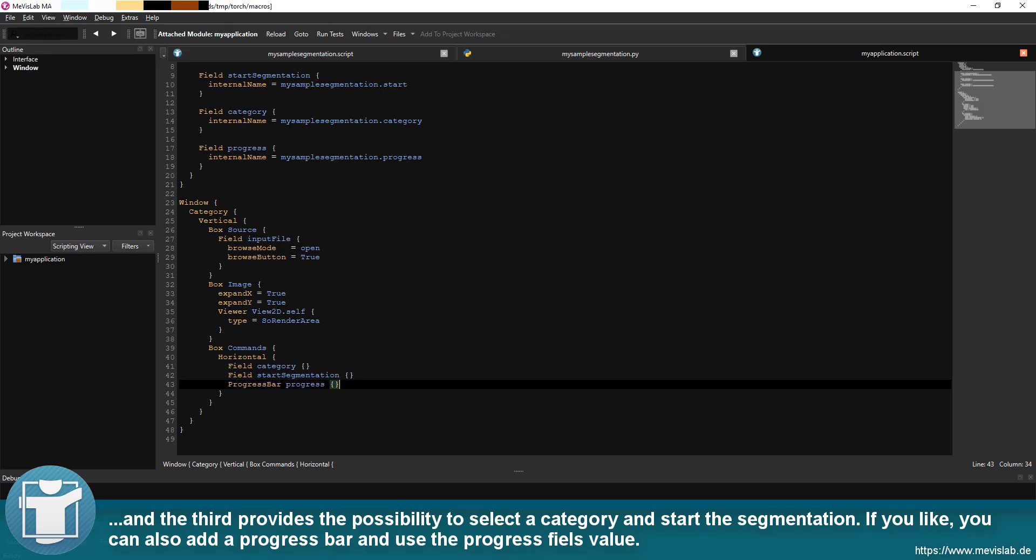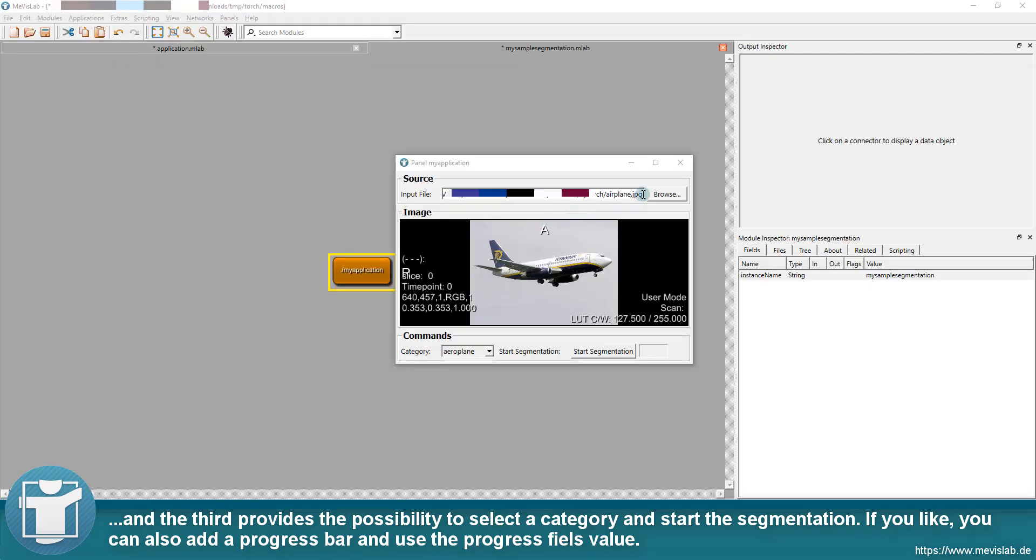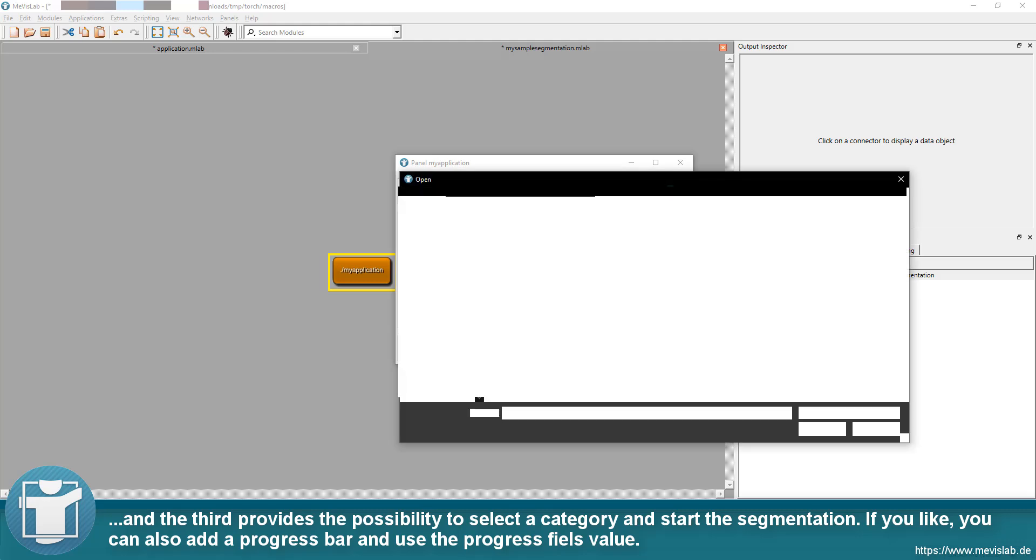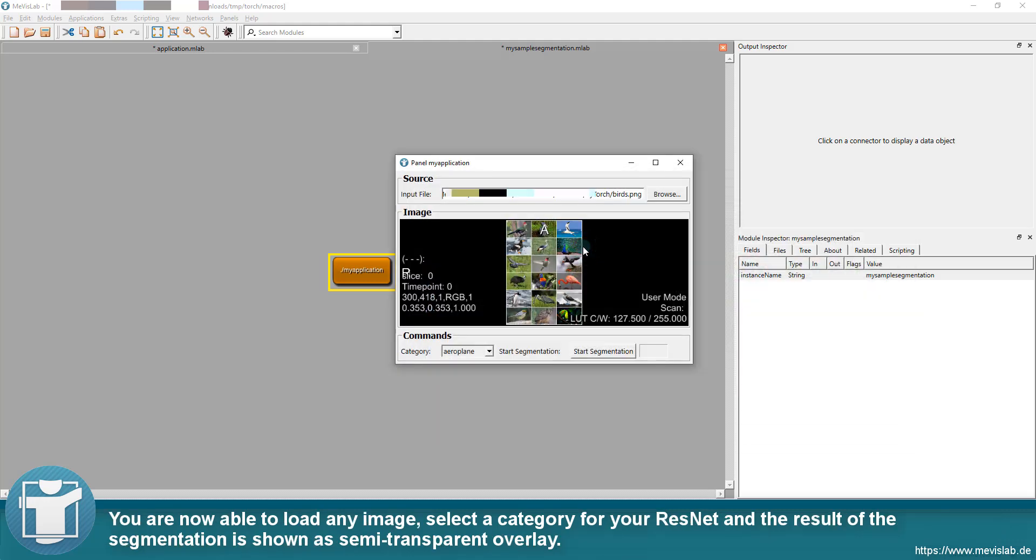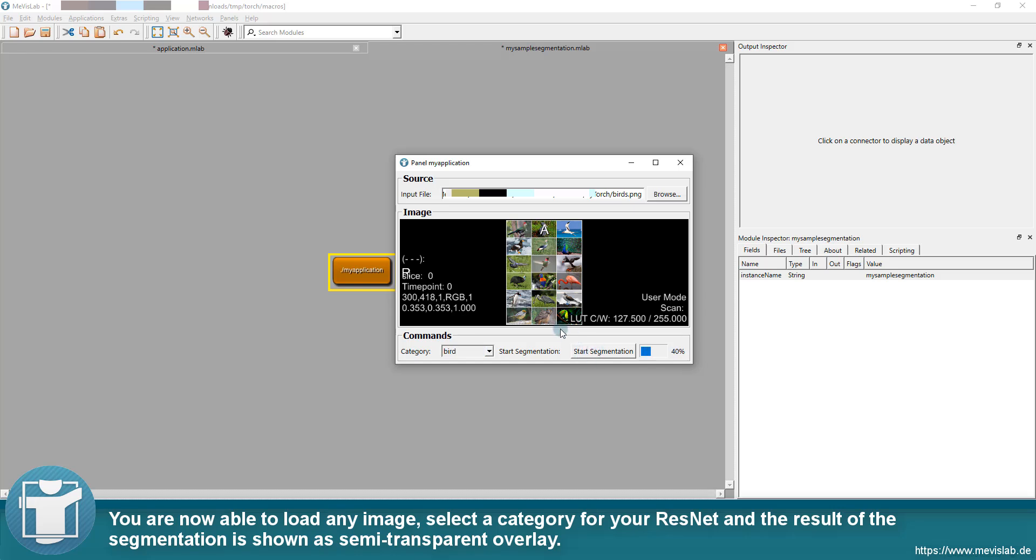If you like, you can also add a progress bar and use the progress fields value. You are now able to load any image, select a category for your ResNet and the result of the segmentation is shown as semi-transparent overlay.